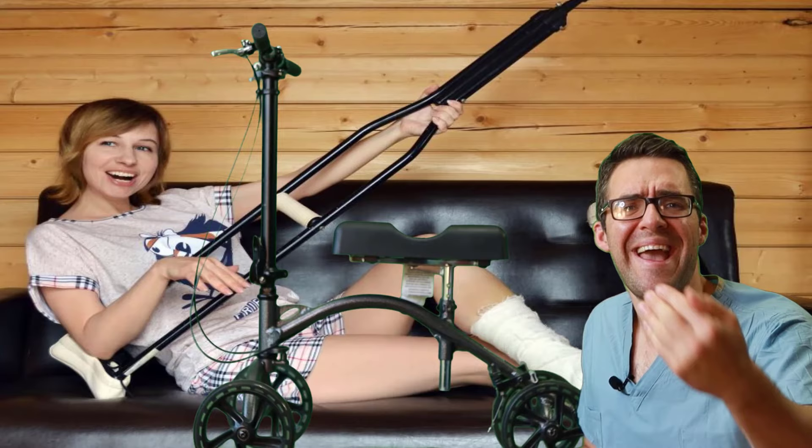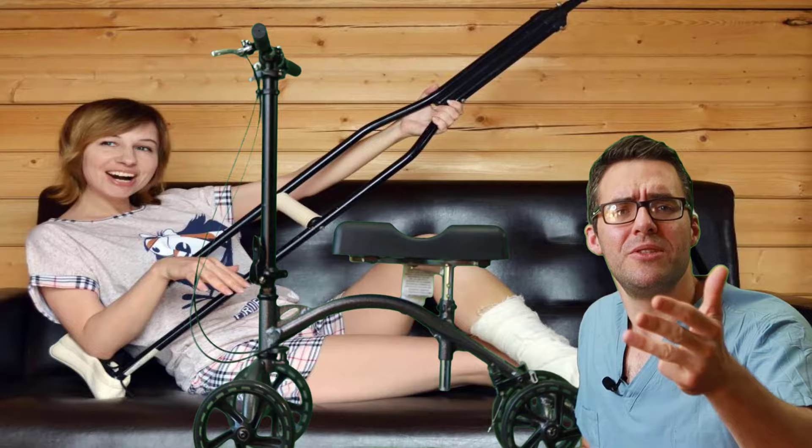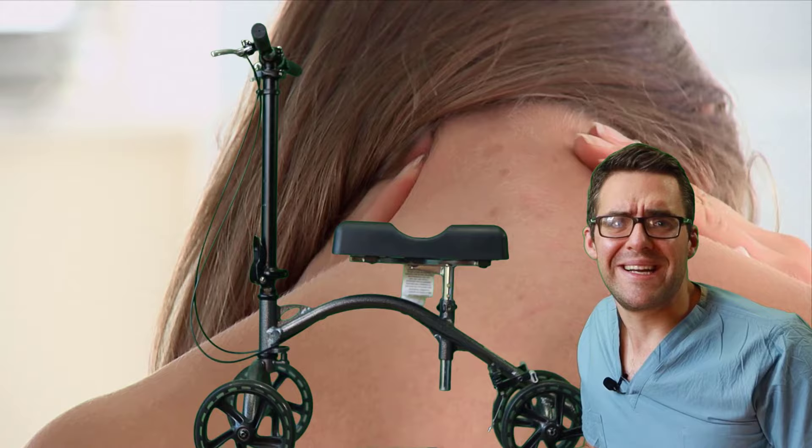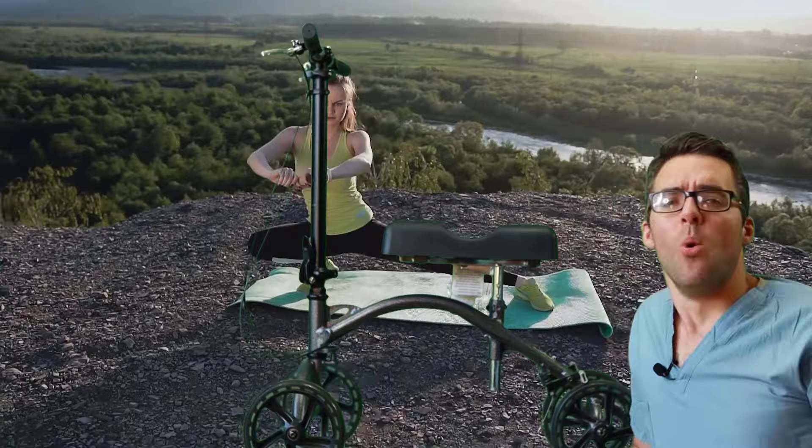Moving heavy distances on the scooter is going to cause back pain, knee pain, and hip pain — all your joints are going to be off, and even your neck is going to be hurting. So use the knee scooter for outdoor distances, and make sure the handlebars and seat are set at the correct height. Otherwise your joints are really going to be aching.